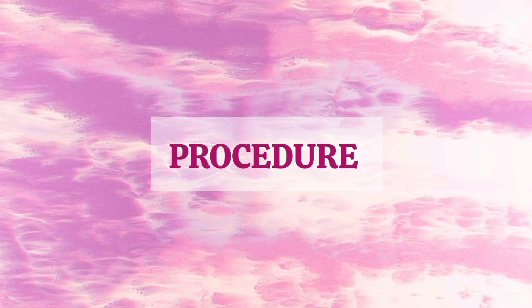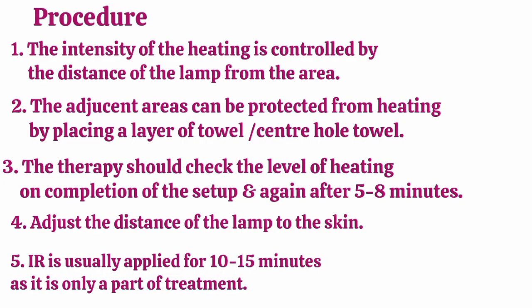Next is the application or the procedure. The intensity of the heating is controlled by the distance of the lamp from the area. The adjacent areas can be protected from heating by placing a layer of towel or a centre hole towel. The therapist should check the level of heating on completion of the setup and again after 5 to 8 minutes, and if required, adjust the distance of the lamp to the skin. IR is usually applied for 10 to 15 minutes as it is only a part of a treatment.